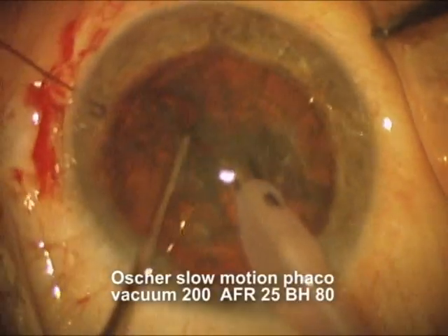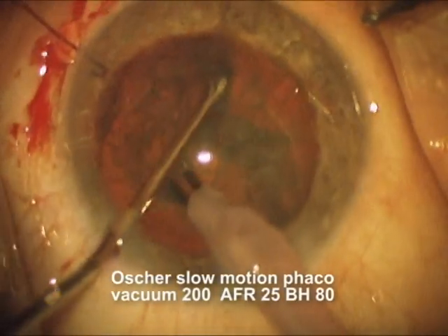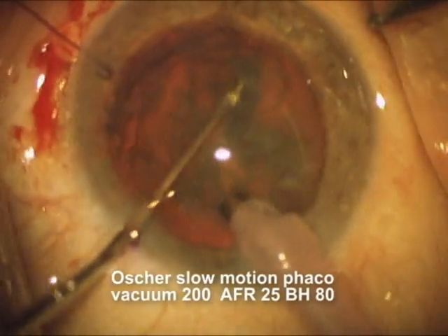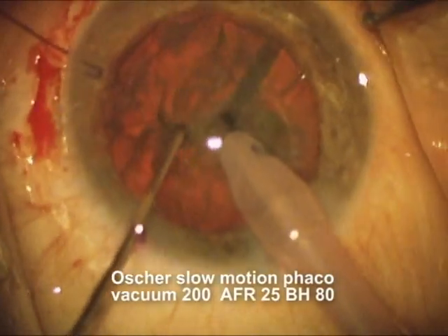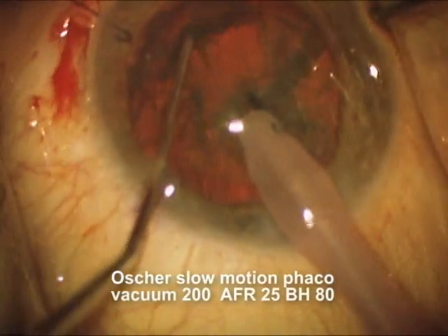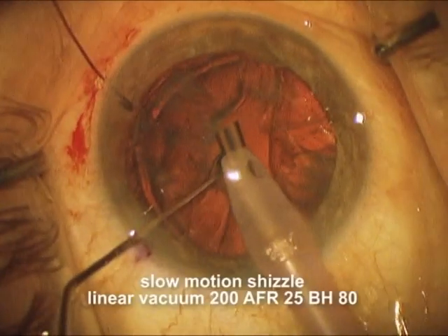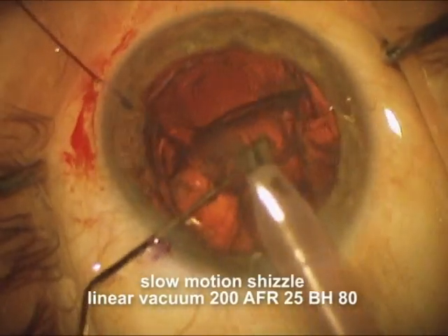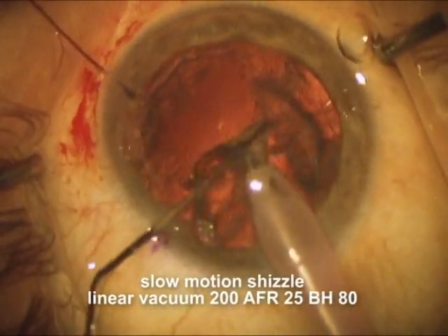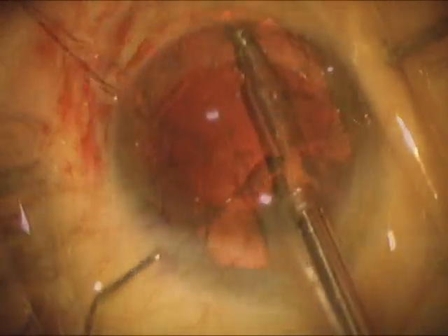Now we're going to slow everything down, as Osher told us, with a slow motion phaco with a low vacuum of about 200, a low bottle height of about 80, and a flow rate of around 25. We're just going to slowly chop this cataract into little pieces and remove it very slowly with very little vacuum, so that we have very little fluid force pushing the zonules further. Here we're doing a phaco chop with a very slow motion amount of vacuum and bottle height to get the residual epinuclear material.